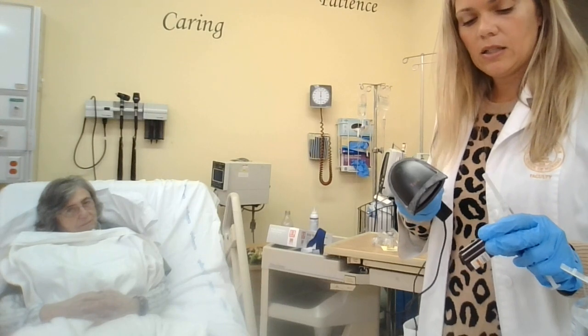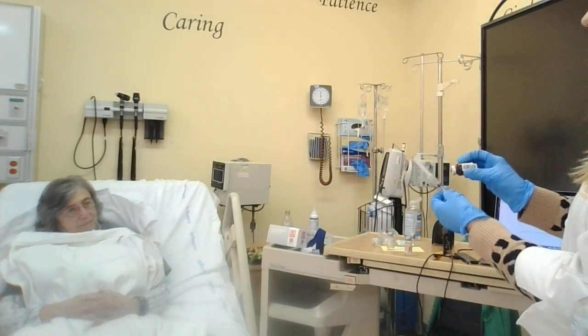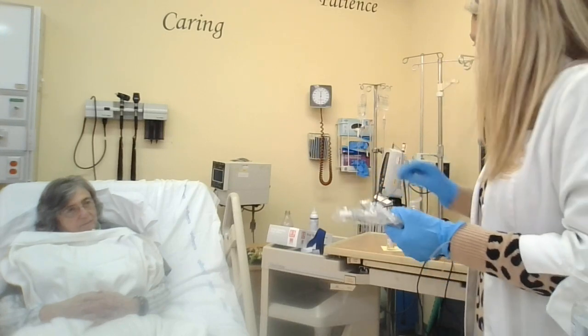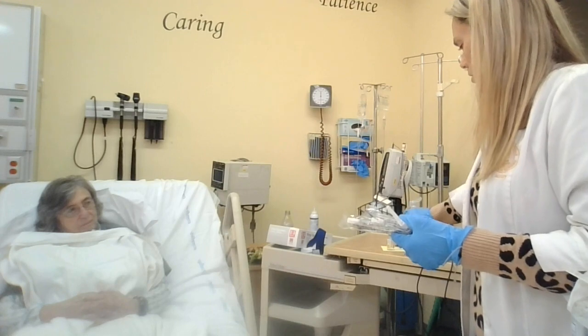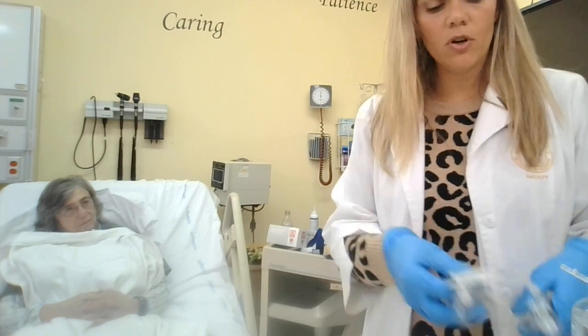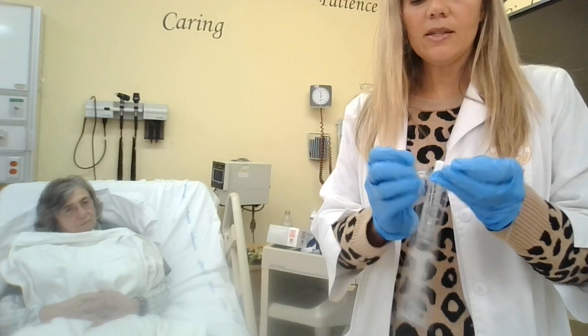So we've scanned it. And now we've got Chris Jones, Lasix, 20 milligrams, 2 mLs, IV push at noon. So I've got with me alcohol swabs. I've got 2 flushes, one for before to check patency, one for after, and I have my actual medication. I recommend go ahead and opening these up.